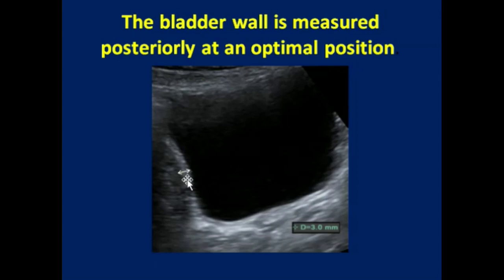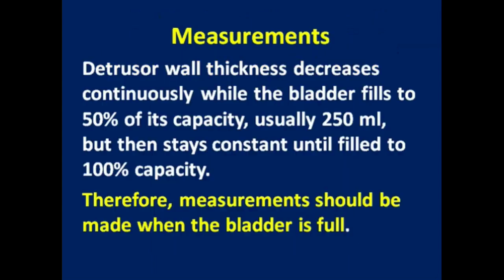This is the image — the bladder wall is measured posteriorly at an optimal position. In this image, the thickness of the wall is three millimeters. The bladder wall thickness decreases continuously while the bladder fills to 50% of its capacity, usually 250 ml.